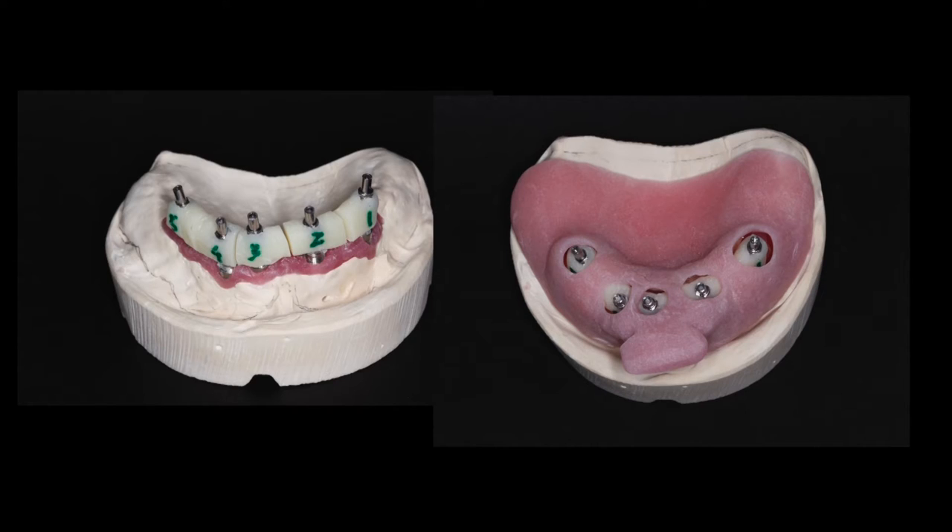The other way to go about the implant verification jig is, once you have your final working cast, you can create a jig on your cast and transfer that into the mouth to verify the relationship between your working cast and the inter-implant position in the mouth.